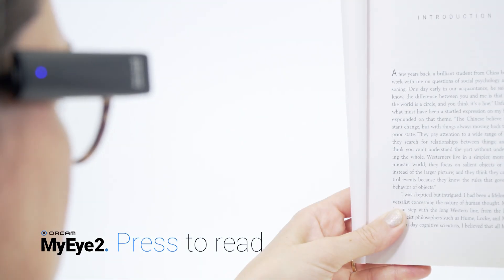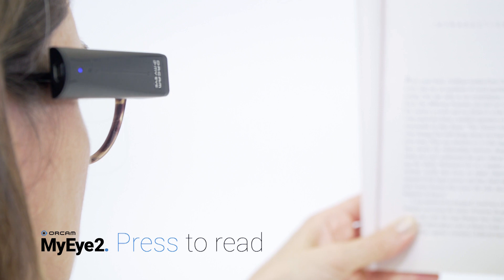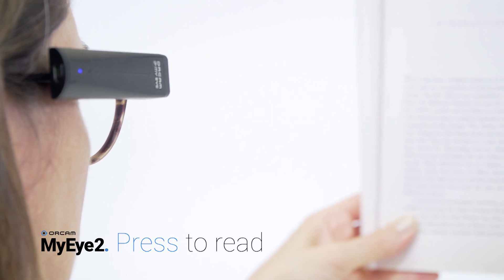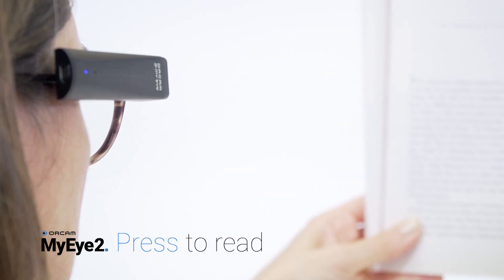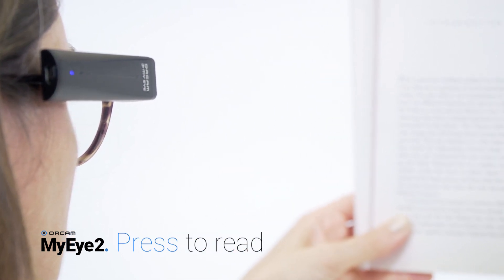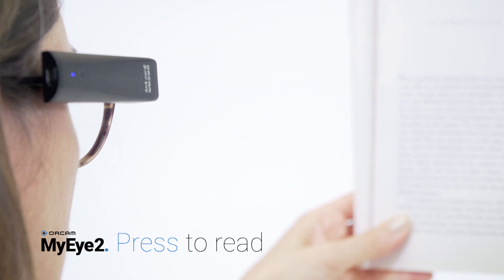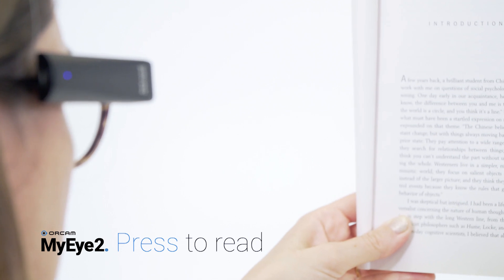Press the touch bar on the device when you wish to read one or two full pages or a sign. Face the text you wish to read at eye level. Press the touch bar — you will hear a click, followed by a camera shutter sound, and beeps as the device processes the picture. Your device will begin reading the text and sound a chime when it is finished.